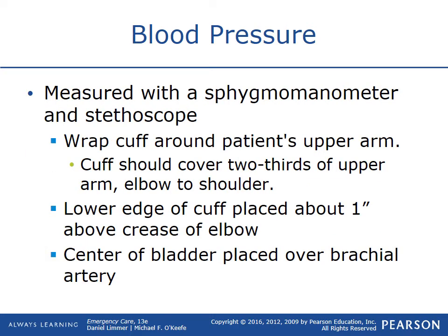Blood pressures are obtained with a sphygmomanometer. That's a very hard word to pronounce, but from here on out, we're just going to say BP cuff or a blood pressure cuff. So you use that and a stethoscope. You wrap the cuff around the patient's upper arm.